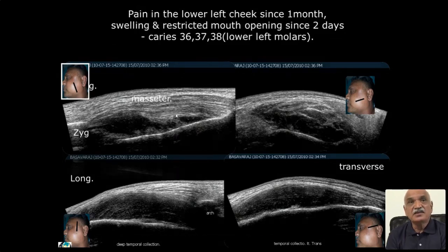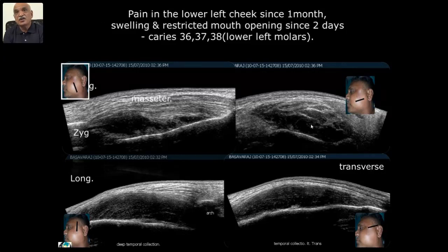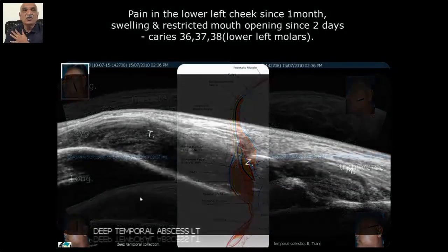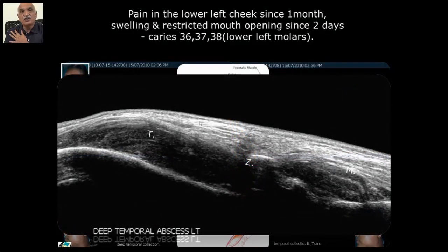The normal masseter is pushed up — it is not invaded, the collection is deep to that masseter. Now the superficial temporalis muscle is pushed away, but the same infection has spread deeper to the temporalis muscle. In the coronal view, the core of the temporalis muscle is elevated. So this is an abscess — we can know at what layer it is involved. The panoramic view from the superficial temporal to the masseter region shows the distribution of infection, confirming a masseteric and temporal abscess.